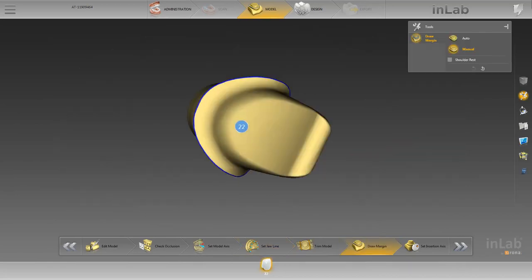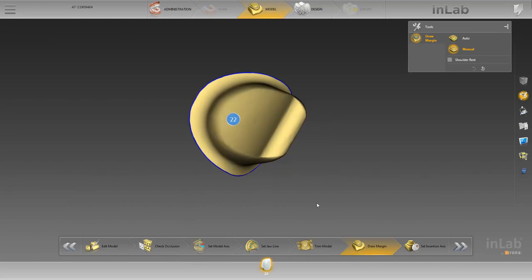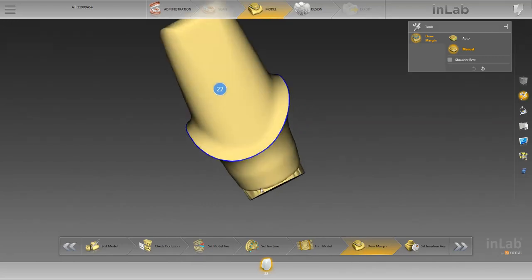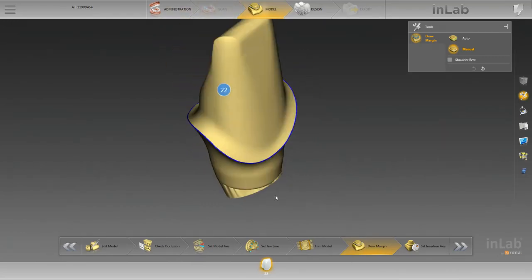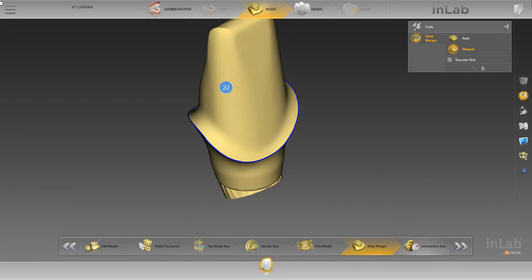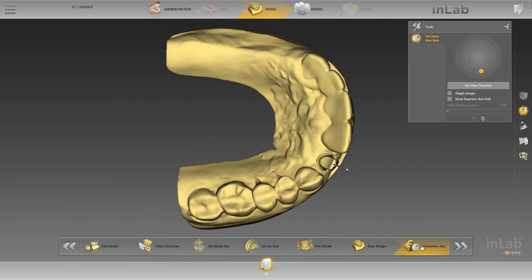We briefly check the preparation margin that has already been defined, and switch to the last step of the model phase, set insertion axis. Since we won't make any changes to the automatically defined insertion axis, we go on with the next phase, the design phase.